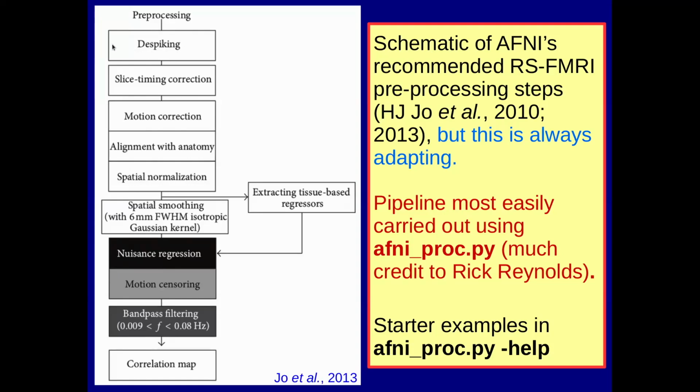We've seen a couple occasions where spikes occur, and those are things we think are obviously not part of our time series. We've seen it bubbling along, and then things that are obviously outside that range. Slice timing correction deals with the fact that in reality, I said that every 2 seconds we take a picture of the brain.